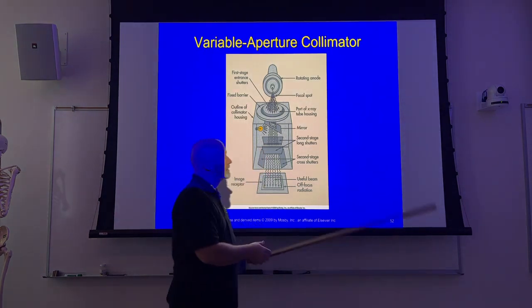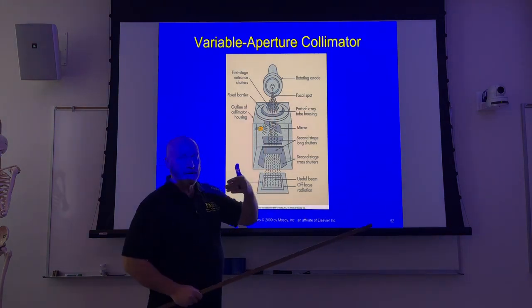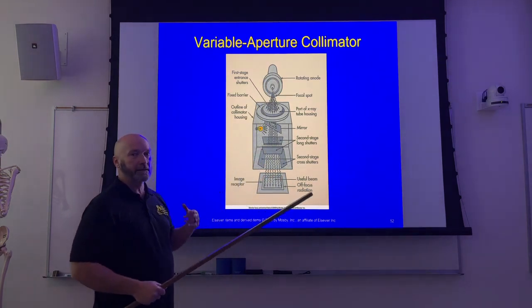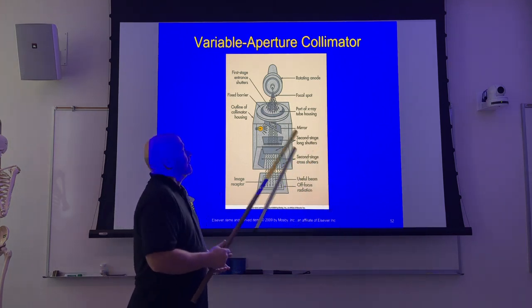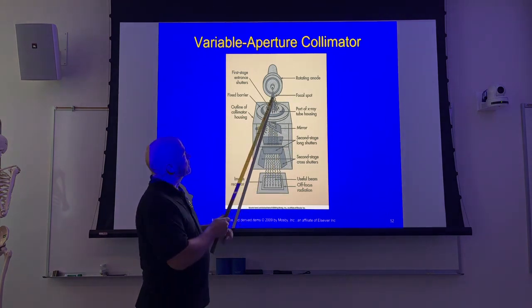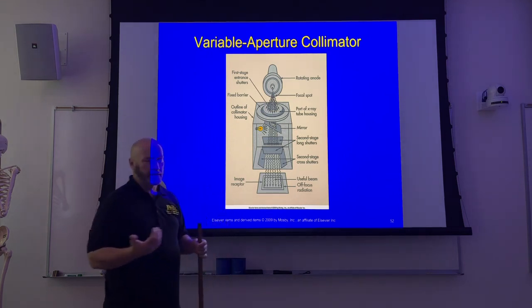And what they might do is they might hit the focal track, the focal point, and they might have a tendency to bounce back towards the cathode. But the anode is still more attractive to the electrons than the cathode is. The cathode is still negatively charged, so they're going to return back over to the anode. And if they return straight back towards the focal track or focal spot, then that's no big deal.